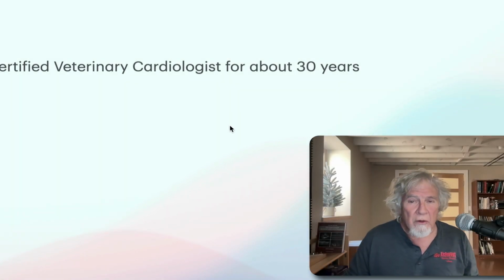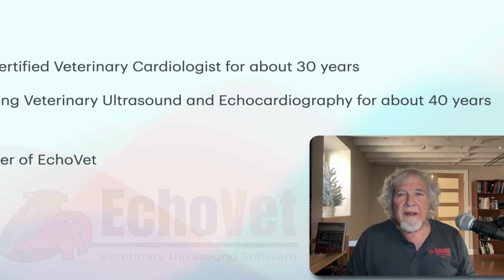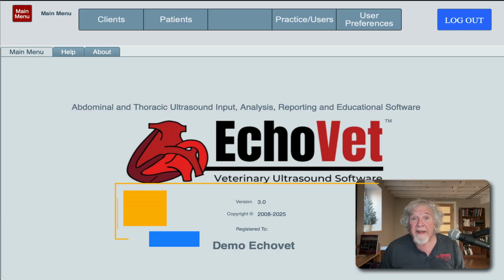Hi, I'm Dr. Carol Lawyer. I'm a veterinary cardiologist, and I'm the founder of EchoVet. I'm going to show you around the EchoVet software and ultrasound software and ecosystem. I'm going to show you EchoVet in action.